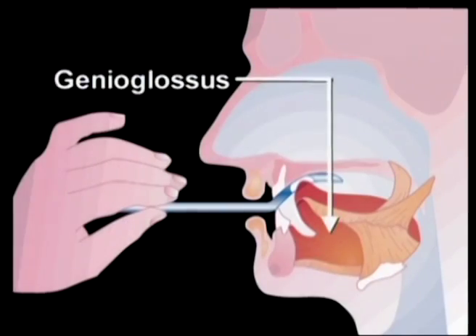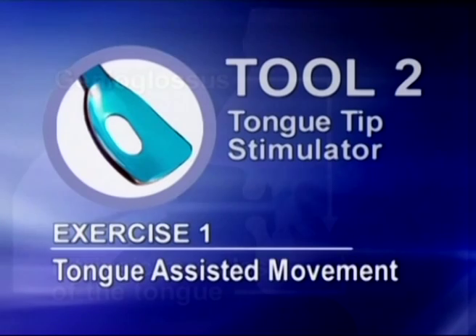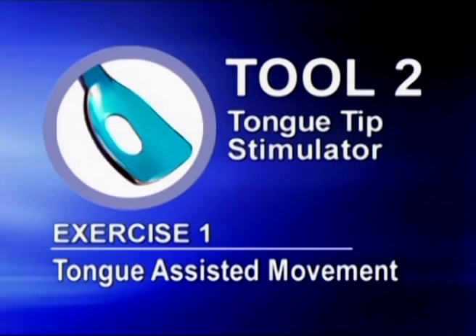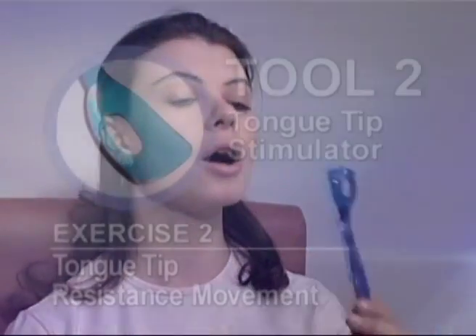Muscles exercised include the genioglossus and intrinsic muscles of the tongue. The goal of exercise protocol 1 is to feel the tongue tip inserted into the hole opening of tool number 2. Place tool number 2 in the palate. Position the tongue tip into the hole opening. This allows the patient to get a tactile feel of contact against the hole opening.